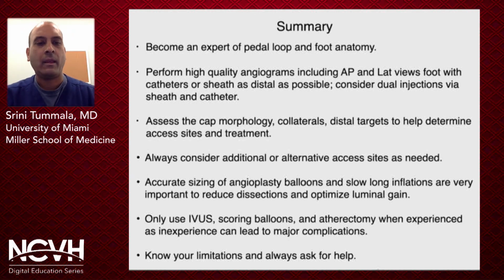Only use scoring balloons and atherectomy below the ankle when you're very experienced with pedal loop interventions, because as you can imagine, inexperience can really lead to major complications and limb loss. So know your limitations and always ask for help.